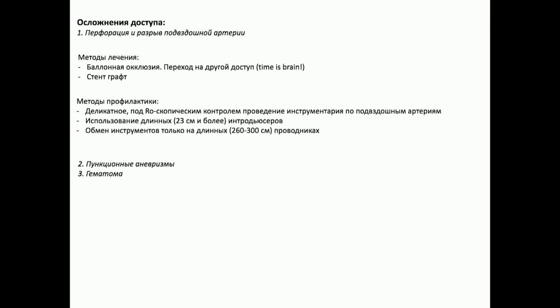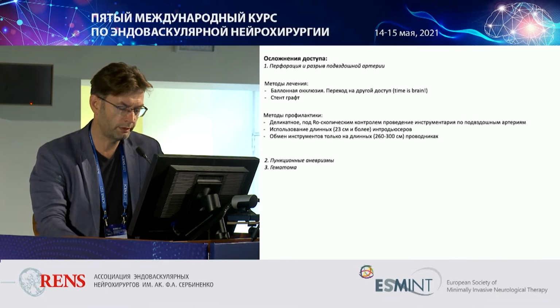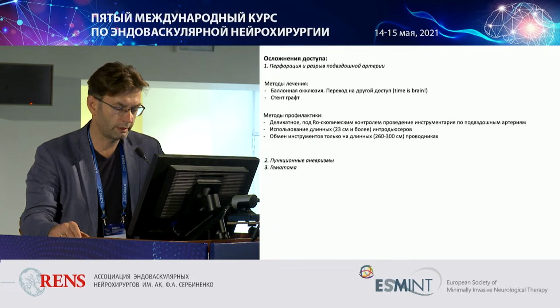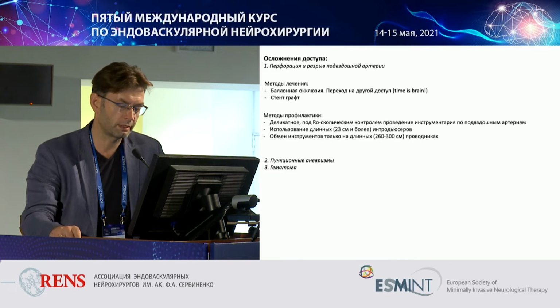And you'd better perform proper prophylaxis of such complications. If you have problems with iliac arteries, you have to perform angiography and see where the tool goes, and see if there is any stenosis. In case you have a rupture or a dissection, you have to perform balloon angioplasty using a peripheral catheter of about 10 millimeters diameter at low pressure.